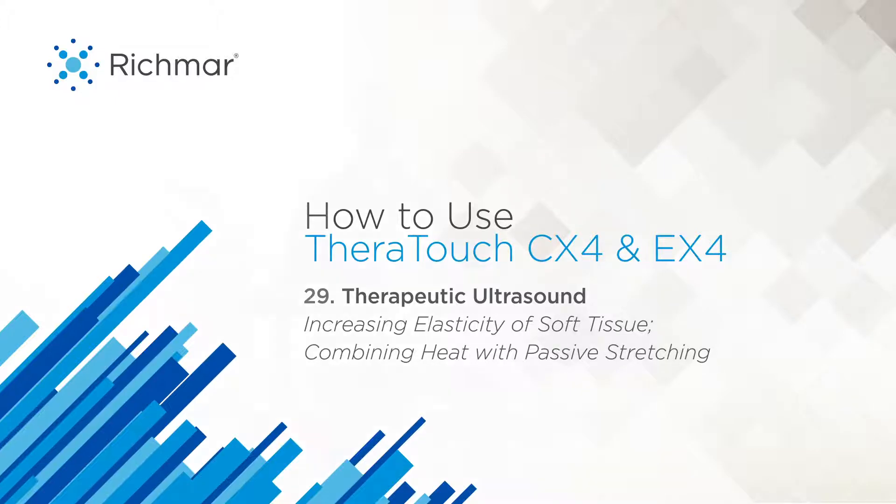Therapeutic ultrasound with your Theratouch CX4 combo unit. The treatment approach in this segment is utilizing thermal ultrasound to promote vigorous heating in tendons. The mechanism of action is therapeutic heating to increase tissue temperature and promote vigorous heating to increase the viscoelasticity of soft tissue.